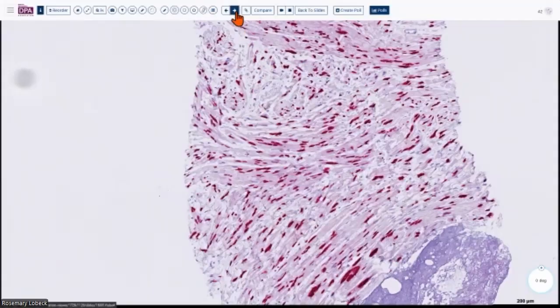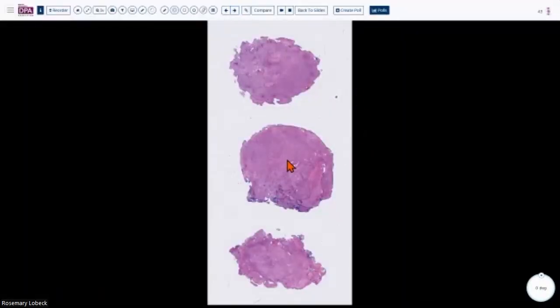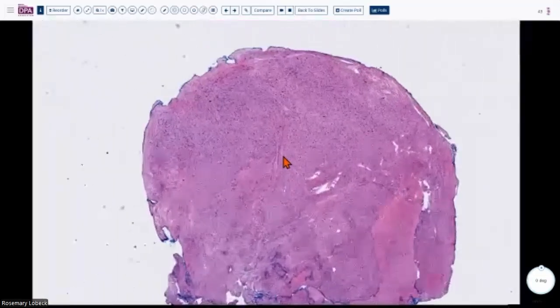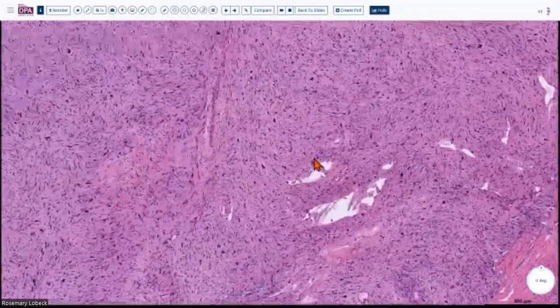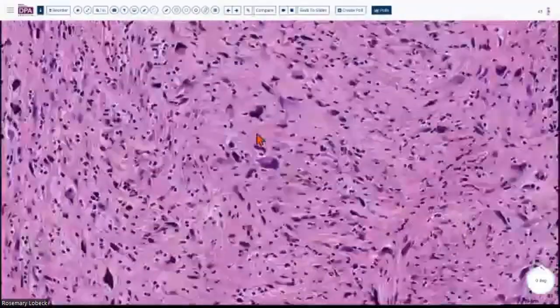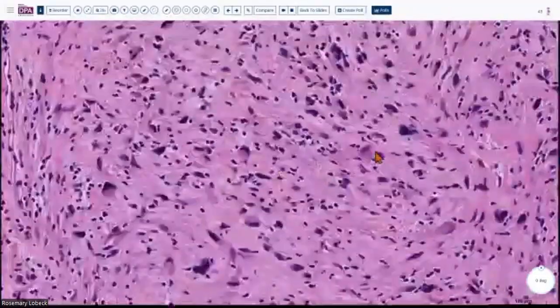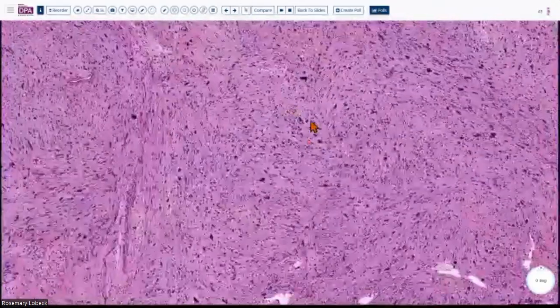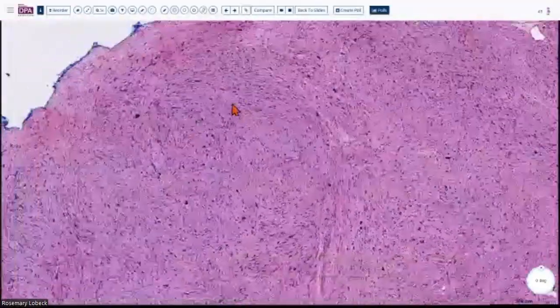And I want to show you another example over here, which is even worse than the biopsy we just saw. As you can see from this low magnification, it's a nicely circumscribed, very, very small lesion, smaller than a marble probably. But if you look closer, you will see that there is so much atypia here, like significantly enlarged nuclei, hyperchromasia, again, irregular nuclear borders. But in this particular case, a helpful clue is that, again, it's very small, of course, and you don't have any mitotic activity at all. So this is often a helpful clue in schwannomas with ancient or degenerative change.